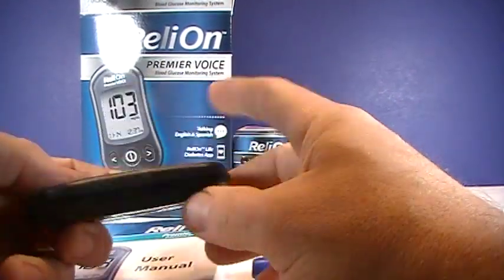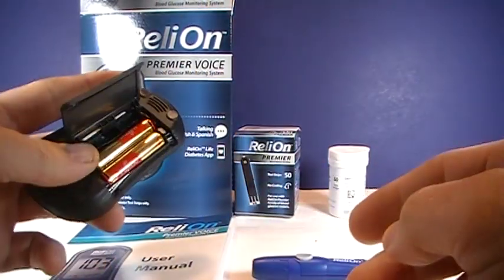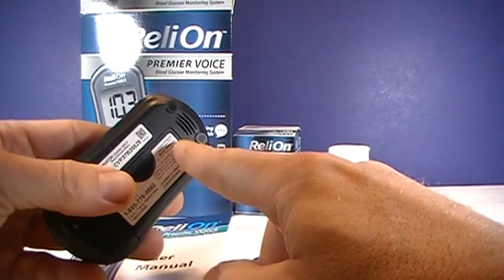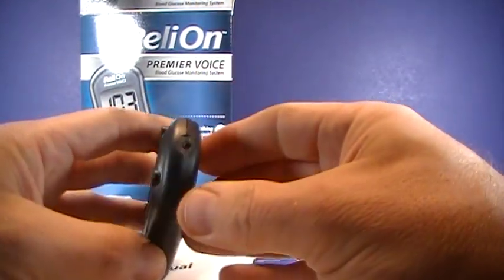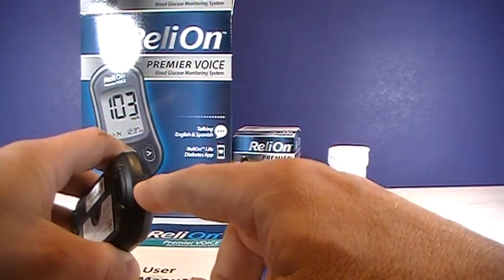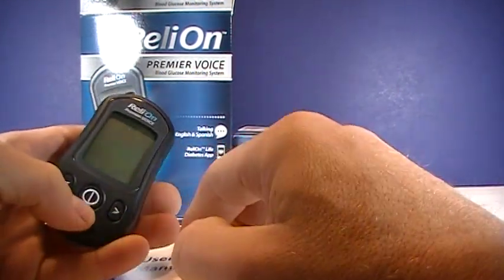There's the meter. One nice thing — it takes AAA batteries, right there, easy to change out. On the back, that's the speaker — that is where the sound comes from. There is an optional computer cable that can connect to the top. And then there's the readout screen and controls.